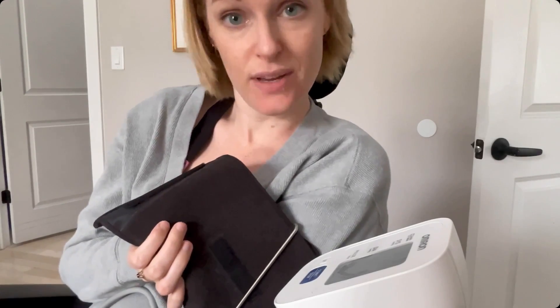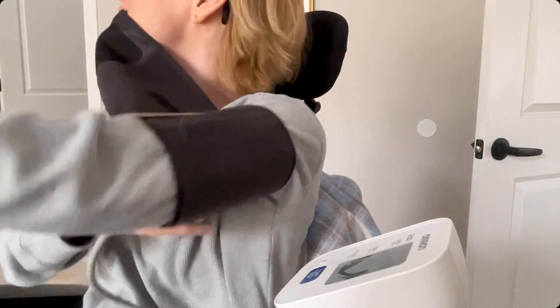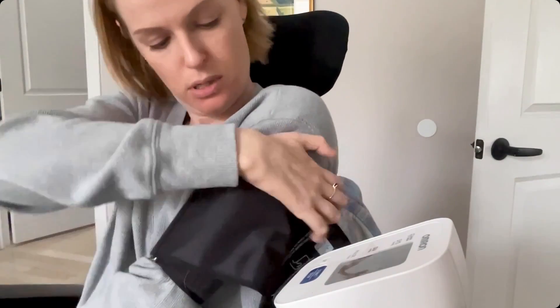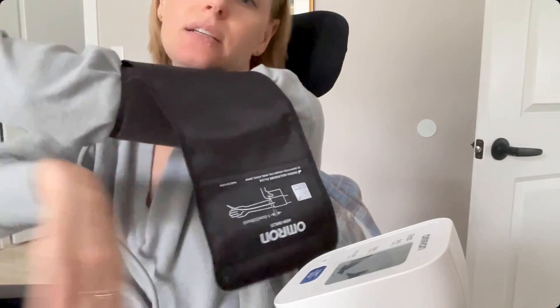You're kind of just going to pull it with your teeth around your arm as tight as you can. Then it'll work just fine. There you go — it doesn't have to be perfectly straight; as long as it's on there, it will work.